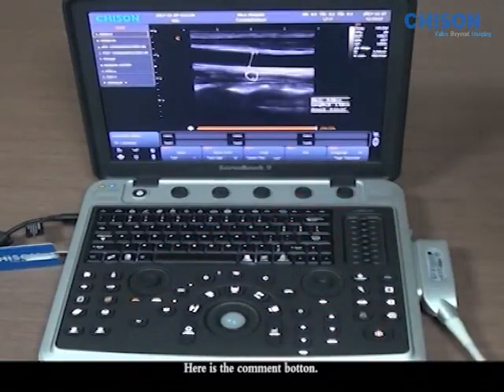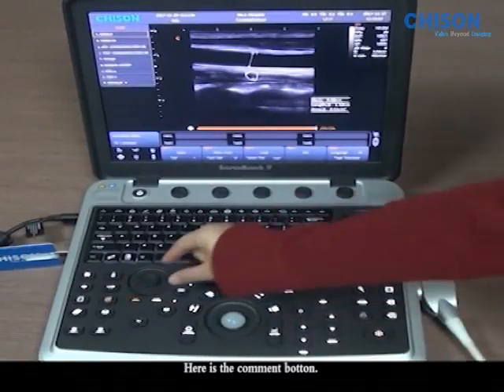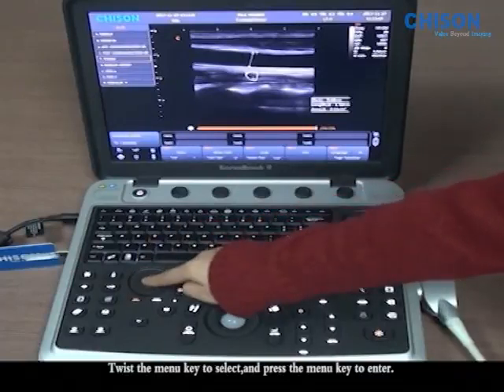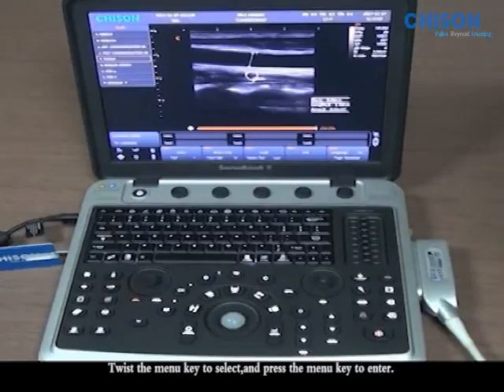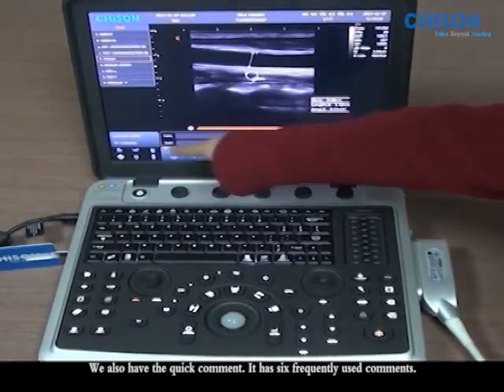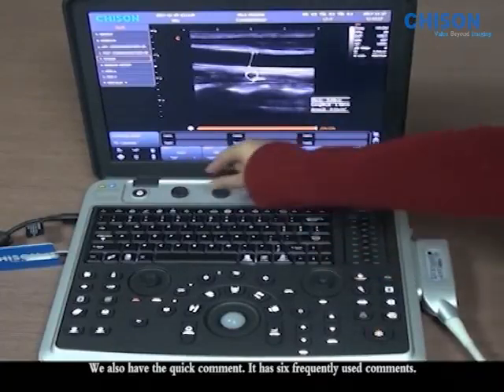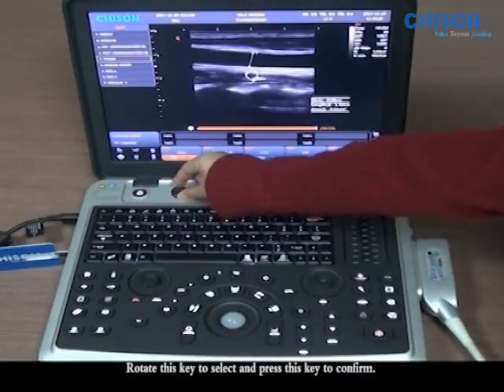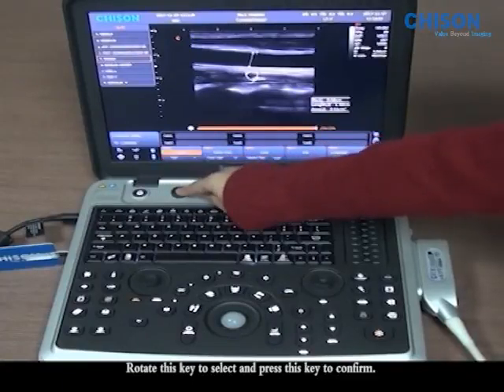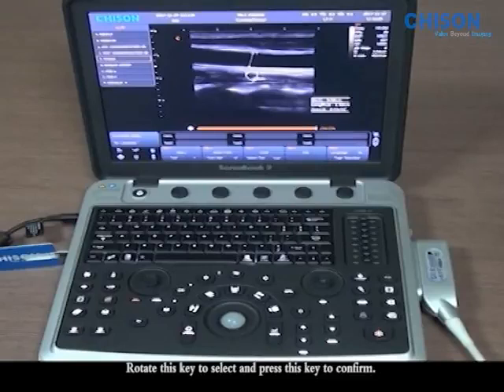Here is the comment button. Twist the menu key to select and press the menu key to enter. We also have the quick comment. It has 6 frequently used comments. Rotate this key to select and press this key to confirm.